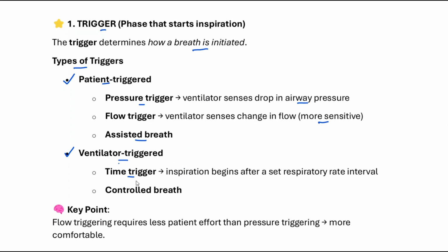Moving on to ventilator trigger. For ventilator trigger, this is a time trigger. That means inspiration will begin after a set respiratory rate interval. Because this one is time triggered and you set the rate, we call this a controlled breath.